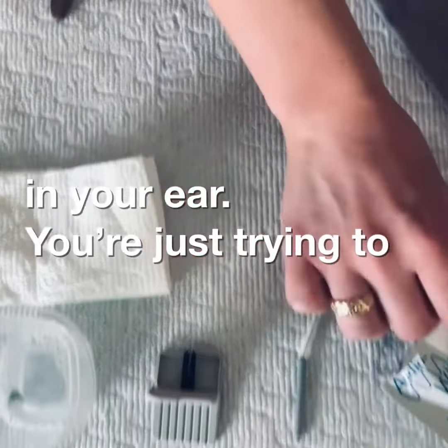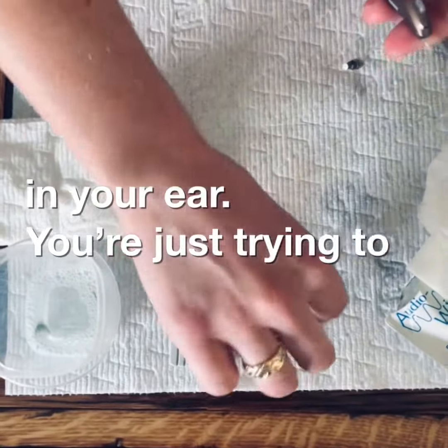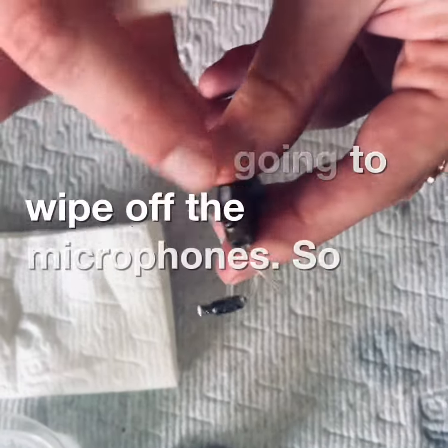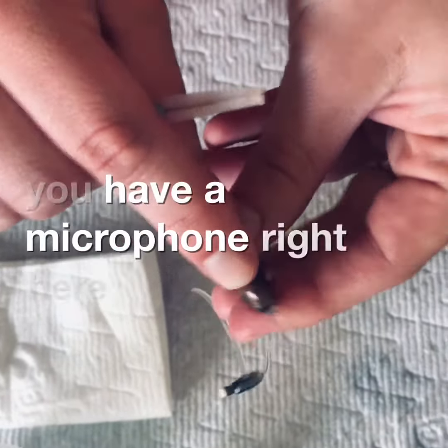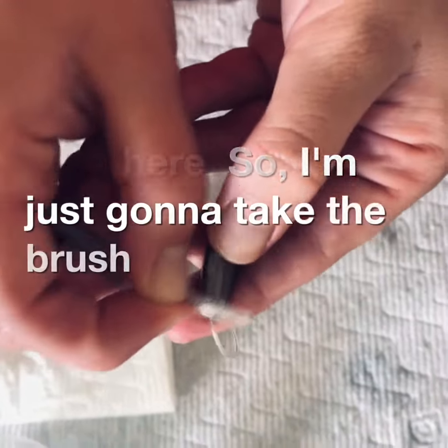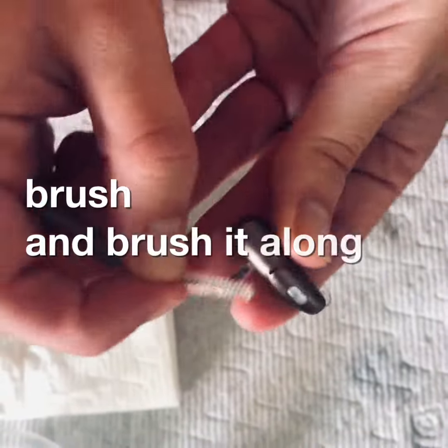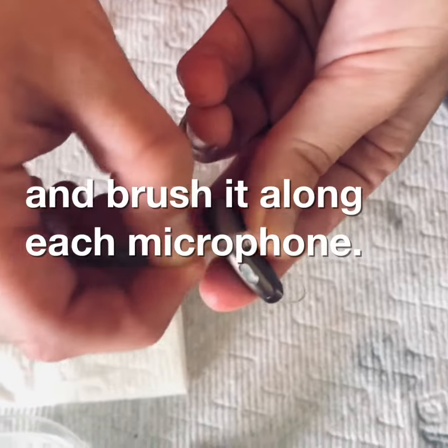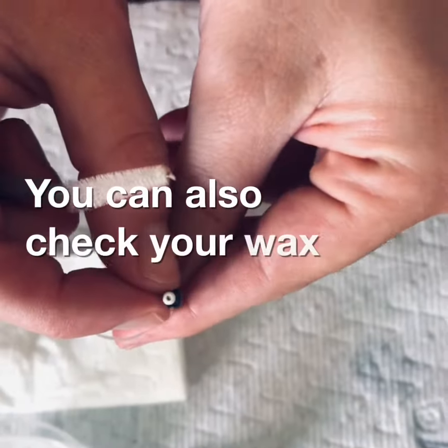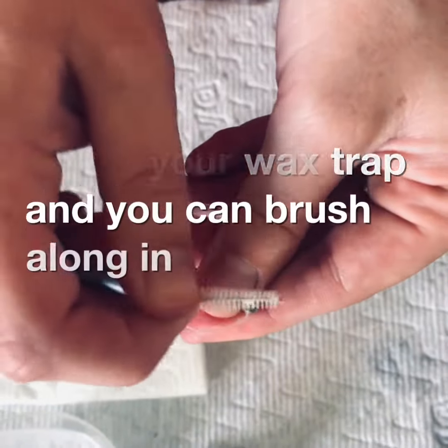You're just trying to get off any debris that you may see. Once you feel like that's good, take your brush and wipe off the microphones. You have a microphone right here and also one right here, so just take the brush and brush it along each microphone.